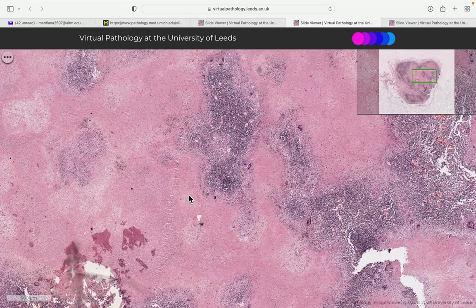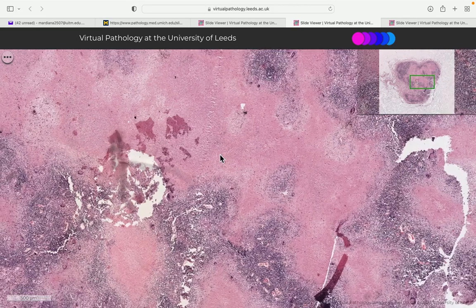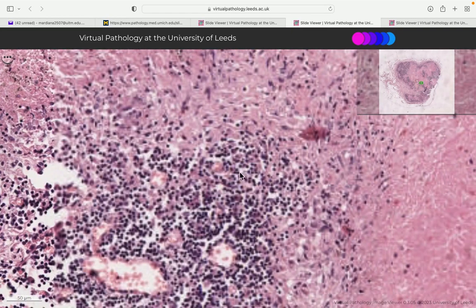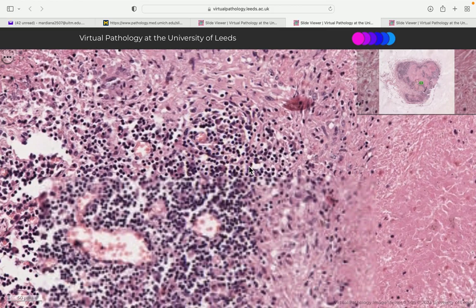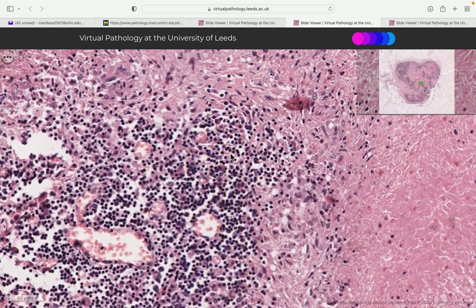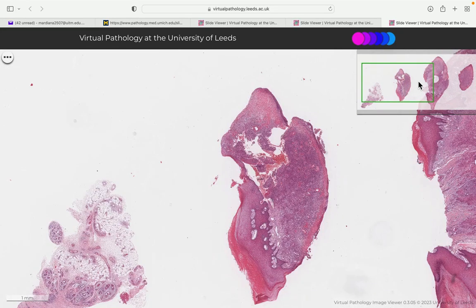And then lastly, in the outermost region of a granuloma, you will find a rim of lymphocytes. Okay, so these are lymphocytes. Lymphocytes are cells which have only one nucleus, so it is a mononuclear cell, and they have very little cytoplasm. So they just look like blue cells, basically. Okay, so that's your granuloma. And lastly, this is granulation tissue.